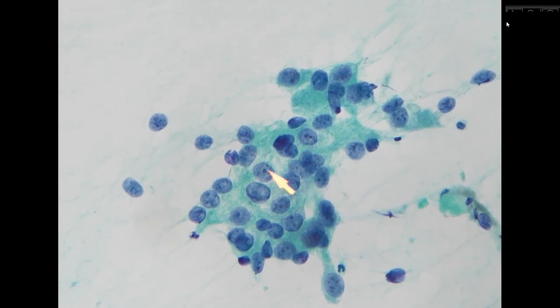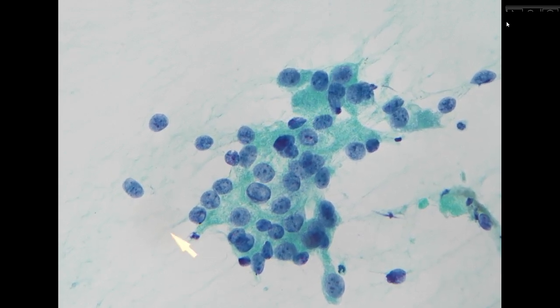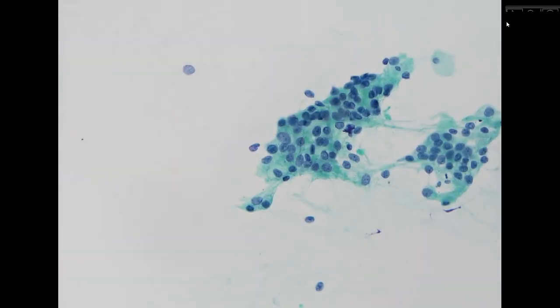So again, here we have an irregularly arranged glandular pattern, much smaller nucleus, much bigger nucleus, all within the same cluster of cells. So this is consistent with adenocarcinoma of the pancreas.